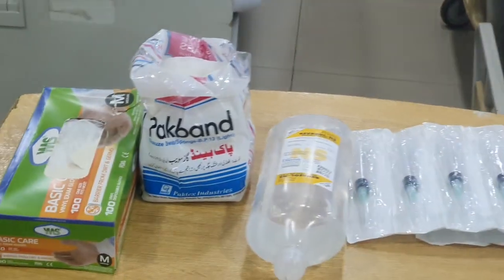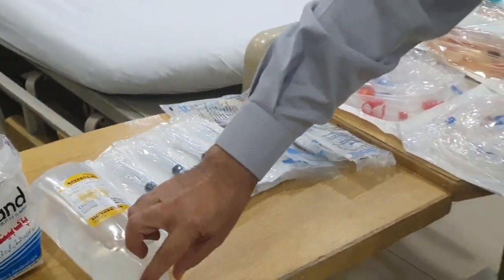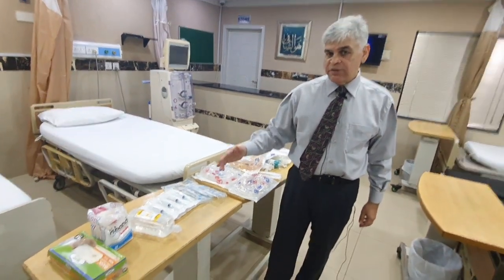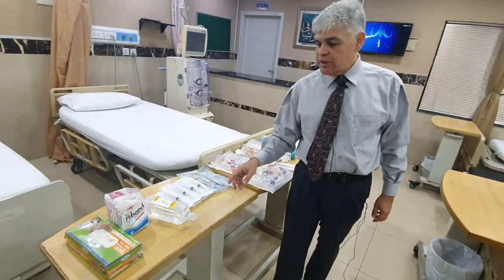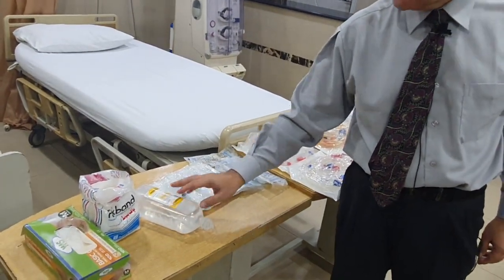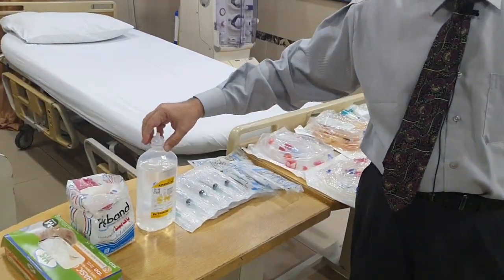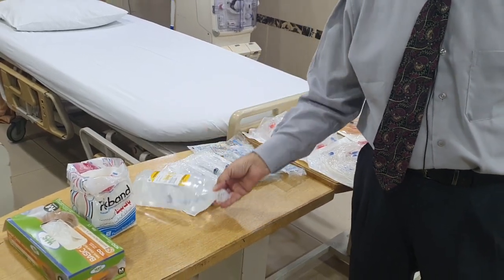Now, these are fairly basic. The reason why we use normal saline is because it is isotonic, which means it doesn't really change much as far as the concentration in blood is concerned. In some situations, you can use dextrose water in those patients who become quickly hypoglycemic. So you can prime them with dextrose water, but normally the standard priming fluid is normal saline, which is 0.9% weight by volume.